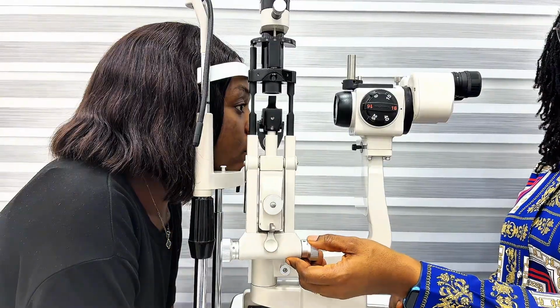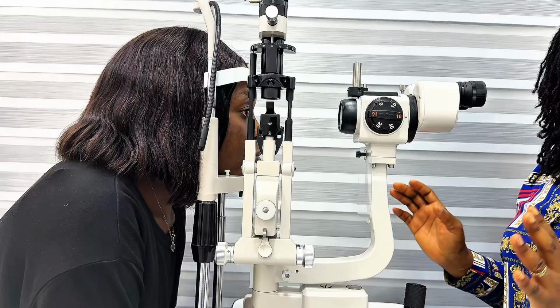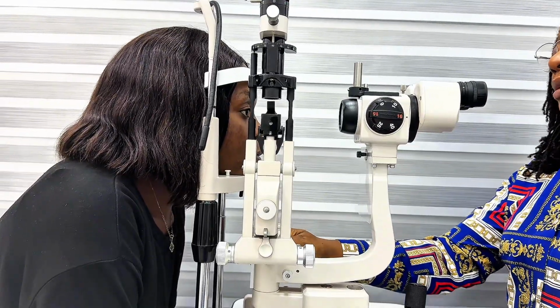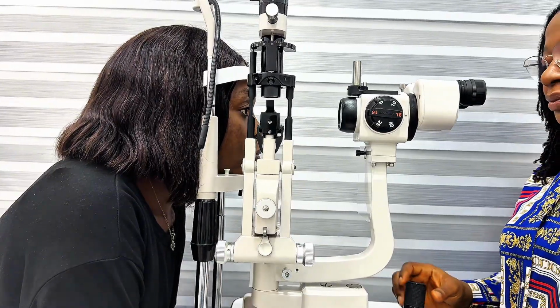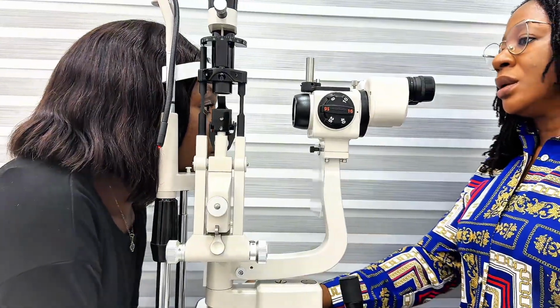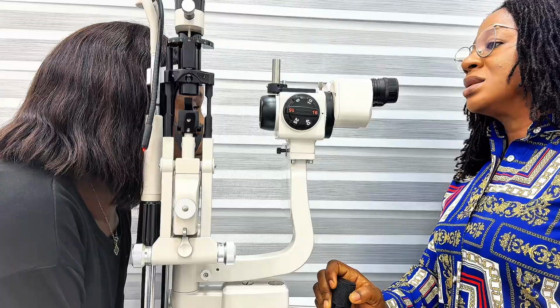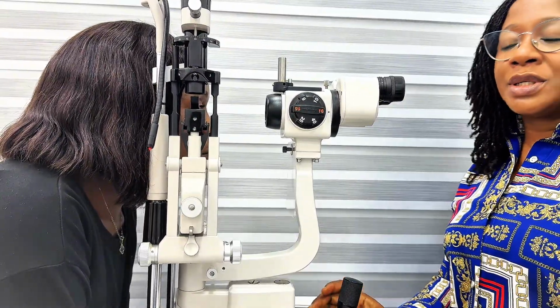I've already set my angle at 60 degrees. If you don't want it to shift, you can lock your angle in place. Then the next thing you have to do is to make sure that the illumination is at the temporal limbus of your patient.